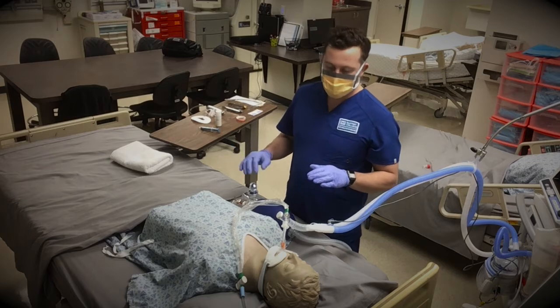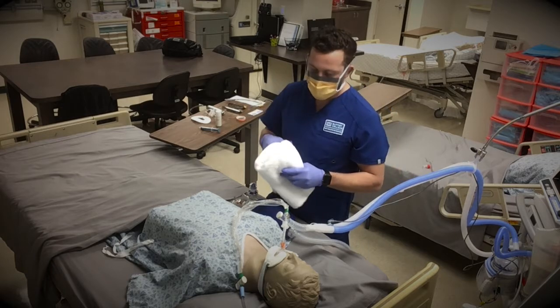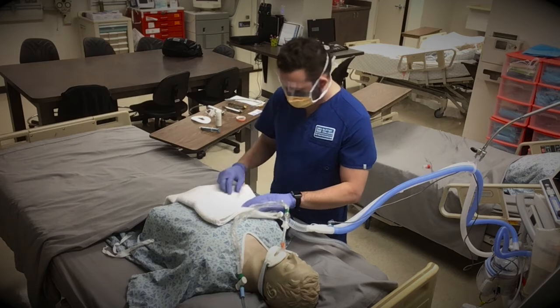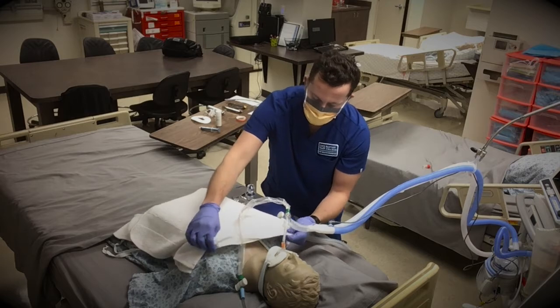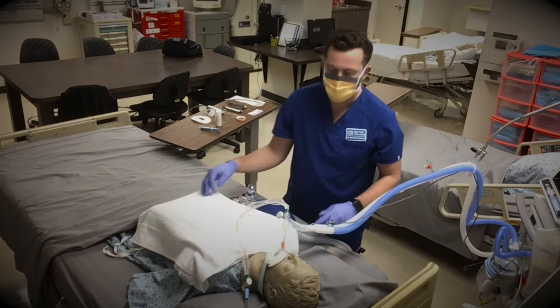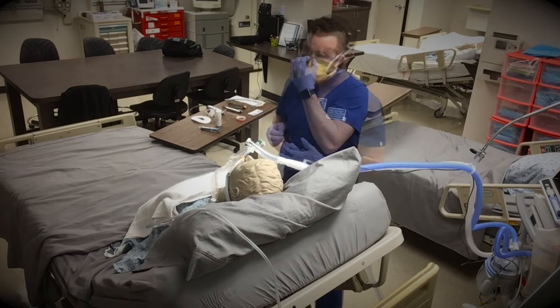Now let's move on to the second step. We've got our supplies in case we have to re-intubate for any reason. Towel: you want to place a towel across your patient because when you pull that tube out, you do not want any secretions to get on the patient, and it makes for easy removal of the tube, and you can discard it in the waste container when you're done. I've got my patient in position. What do I need to do next?